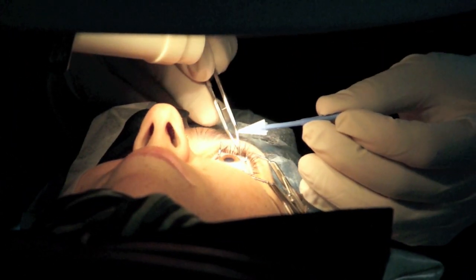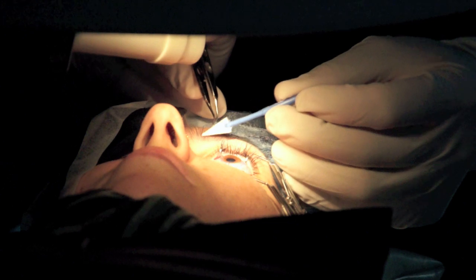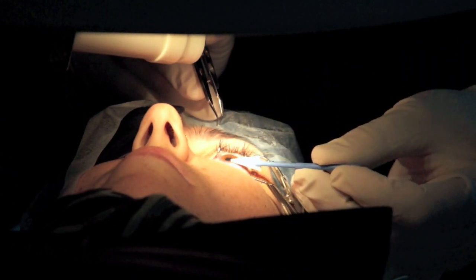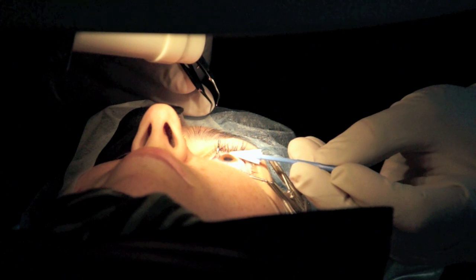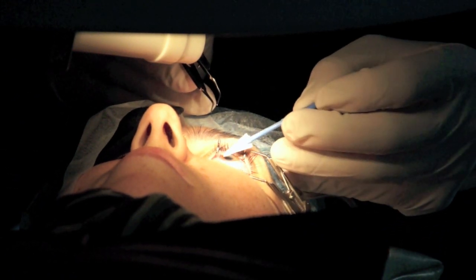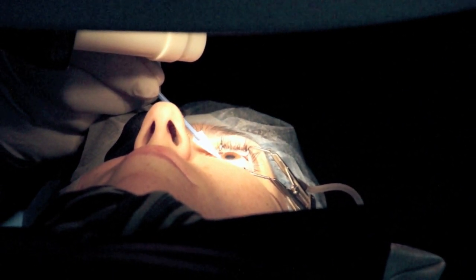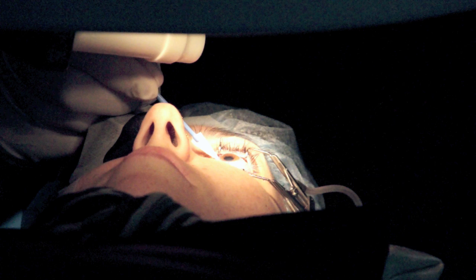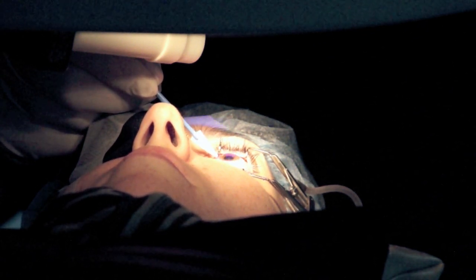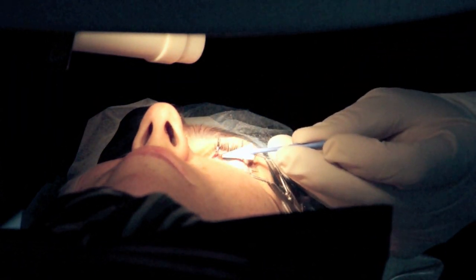It's going to get a little blurry now — that's normal. Good. Just keep looking straight ahead. You'll go another while. Good. Great. We're just going to pause. Try to start — more of you now.